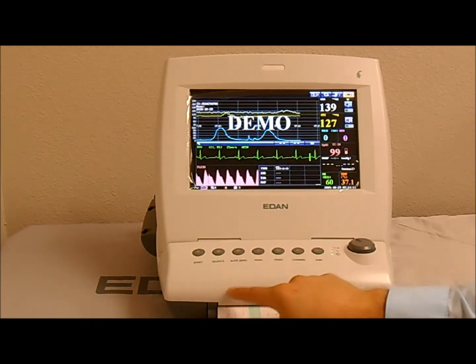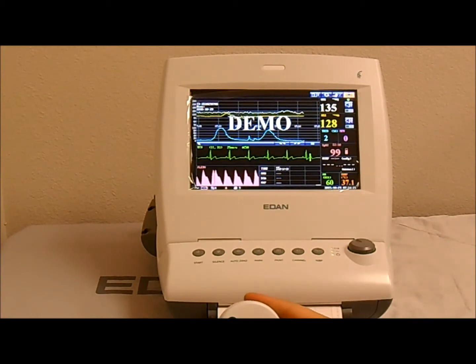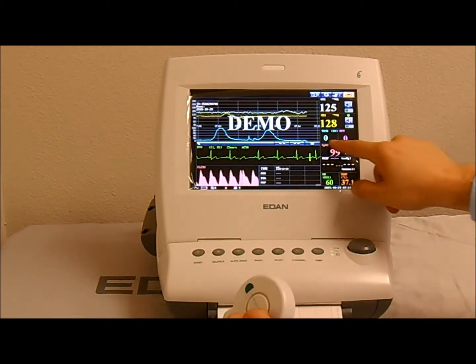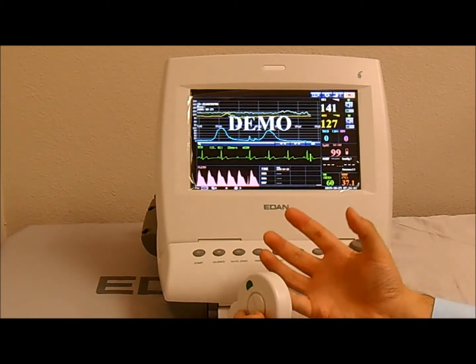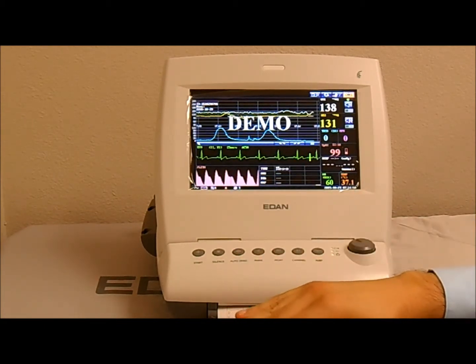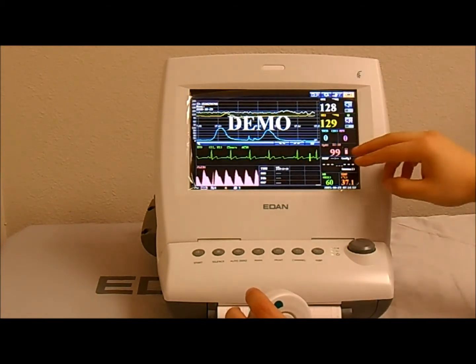Next we have the auto zero. The TOCO transducer is a pressure transducer. When you place it on the patient, just due to the nature that you're going to be putting a belt on it, there's going to be some excess force. So when you first place it, the monitor will give you a TOCO reading, just due to the pressure from the belt. In order to take it back to baseline, you press the auto zero. It'll take it back to the baseline, and only if there's additional pressure as a result of a contraction will the TOCO measurement reading go up.